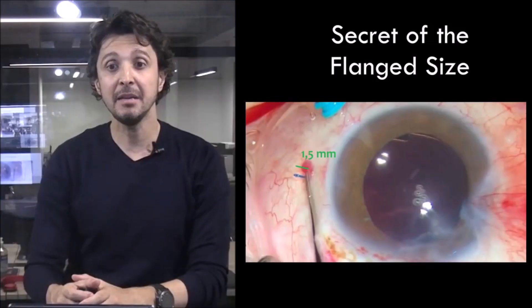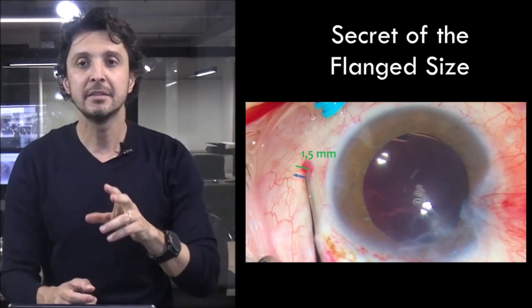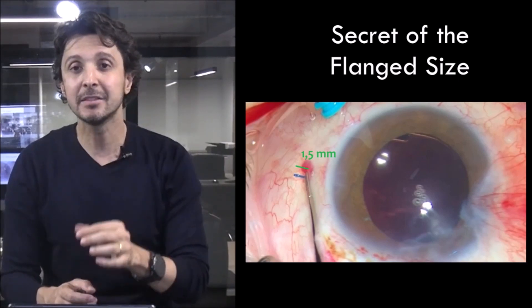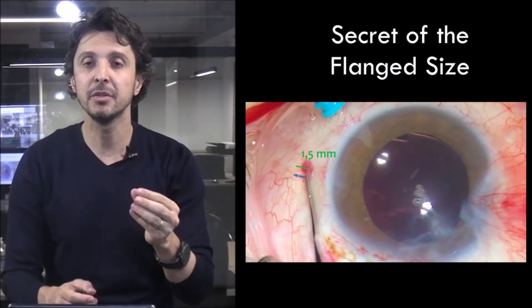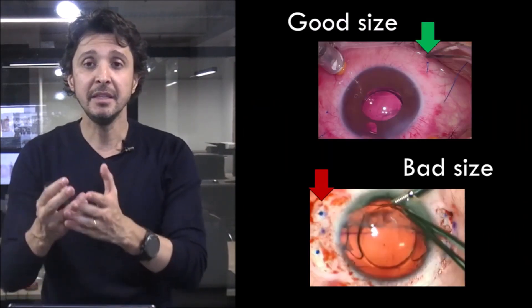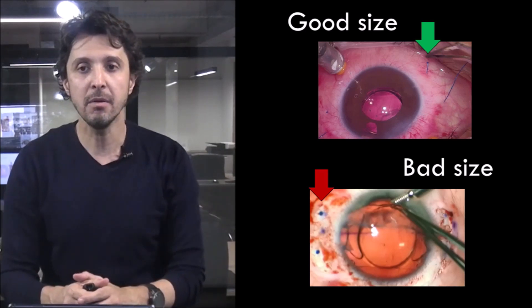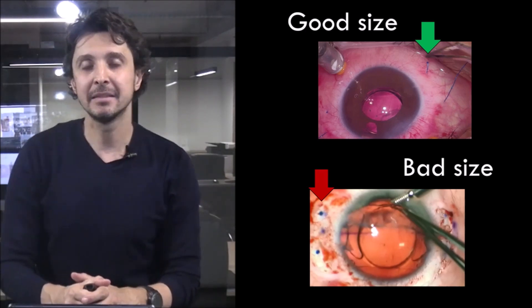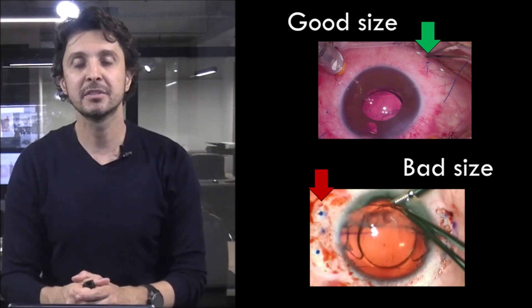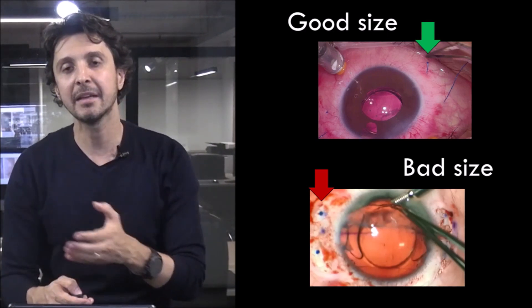The secret of the flange size, as I told you before, is to cut about 1.2 to 1.5 mm from the base, but remember to create some tension before holding the base of the polypropylene. In this image you can see the correct flange size indicated by the green arrow on the left side. The red arrow shows the bad flange size — it is common for surgeons starting out to have this bad size because they are afraid the flange will go back into the eye.